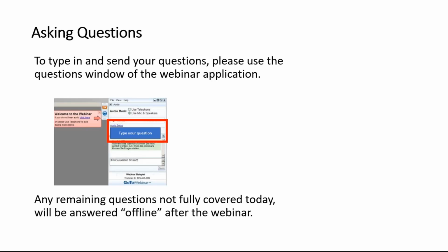Dr. Maltsev, are you ready to answer the first question? Yeah, I'm ready. Perfect. We already have a first question. You mentioned that basically you can now replace fluorescein angiography in CSCR and DME. In how many cases, more or less, do you still need to use FA?